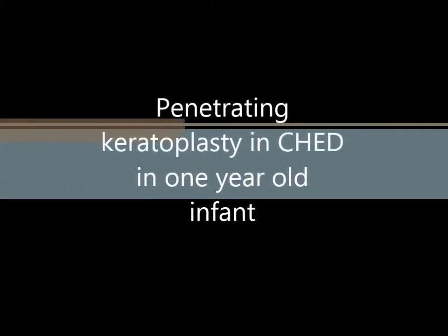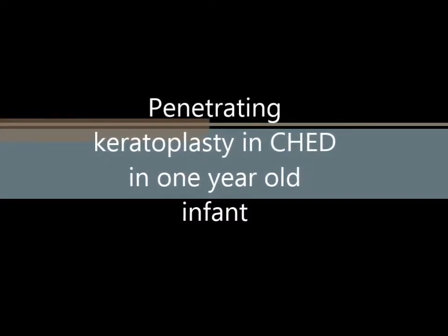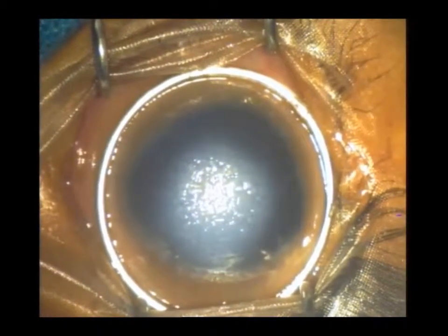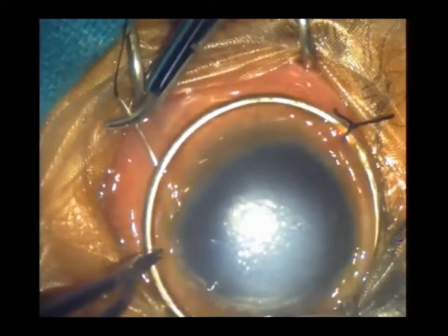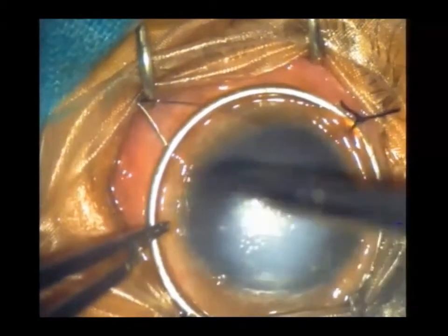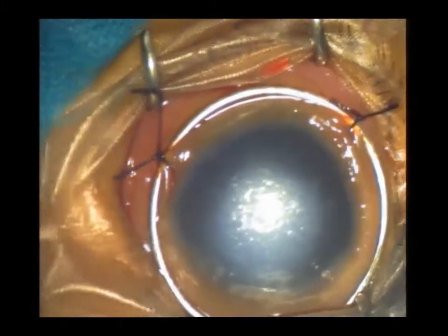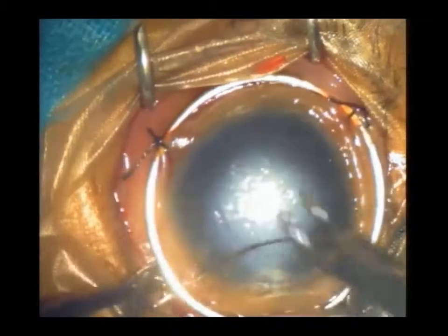This video shows penetrating keratoplasty in congenital hereditary endothelial dystrophy in a 1-year-old infant. First of all, a limbal fixation Flieringa ring is applied to prevent sudden collapse of the globe. The ring is then sutured to the conjunctiva with 4 to 6 fixation sutures.